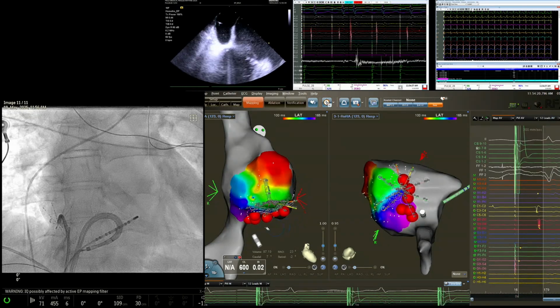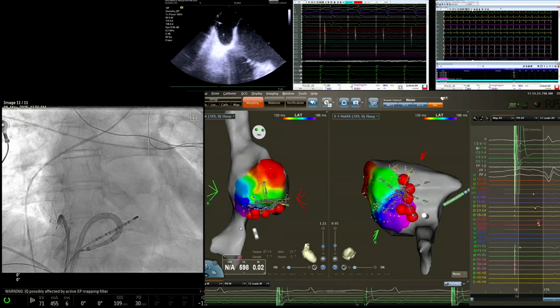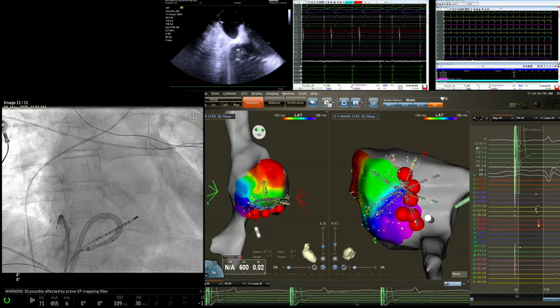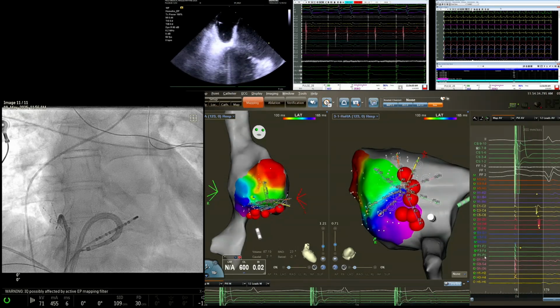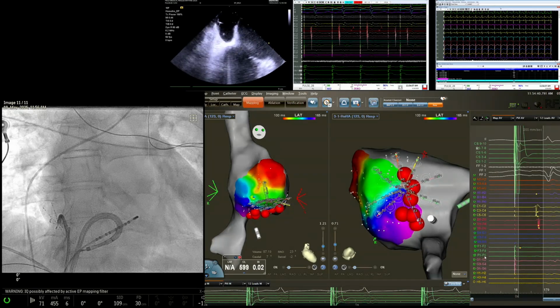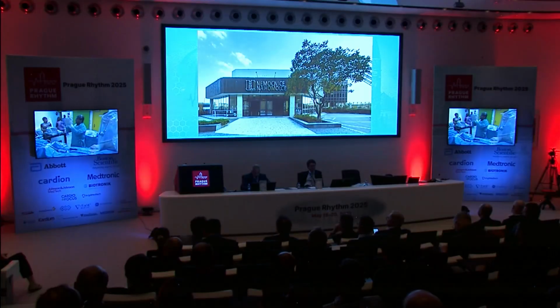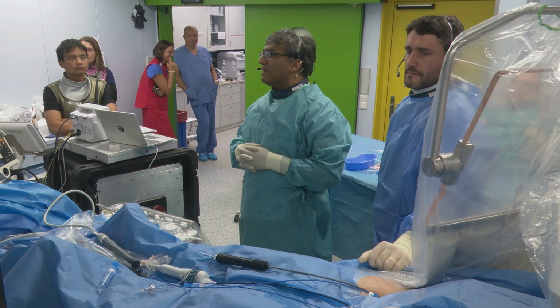Yeah, I think we're happy. So, as I said, this is part of an ongoing series. As you just heard from Honza, we have to remap. We need to understand the durability of the veins, obviously, that's very important, and I'm actually not so worried about that. But I think we do want to understand what is the breadth of the lesion, how wide, because that'll affect how far away we should make these points. Like right now, we put those points pretty close together. Probably we don't need to be that close together.